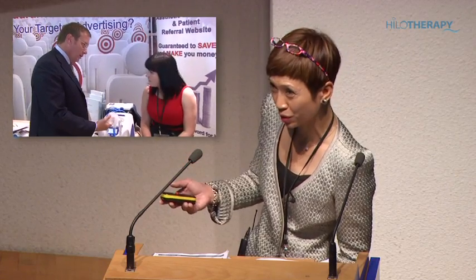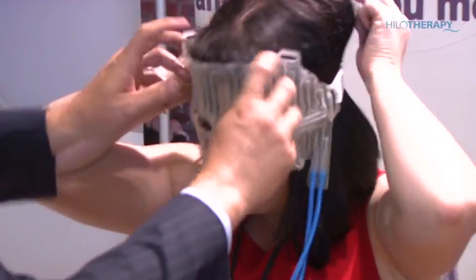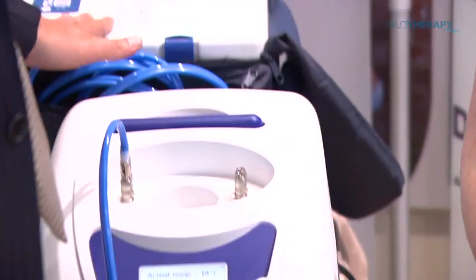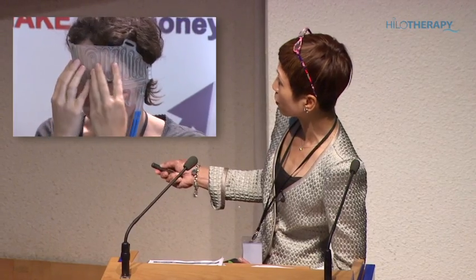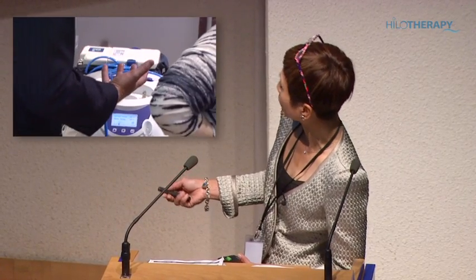I think there is a demonstration set with the exhibitors upstairs. It is a small unit that's about a 1 foot square. It's connected through tubings to the cuffs. The machine is filled with distilled water, which is cooled. It has 2 ports, so 2 patients or 2 cuffs can be connected to the machine at any one time.